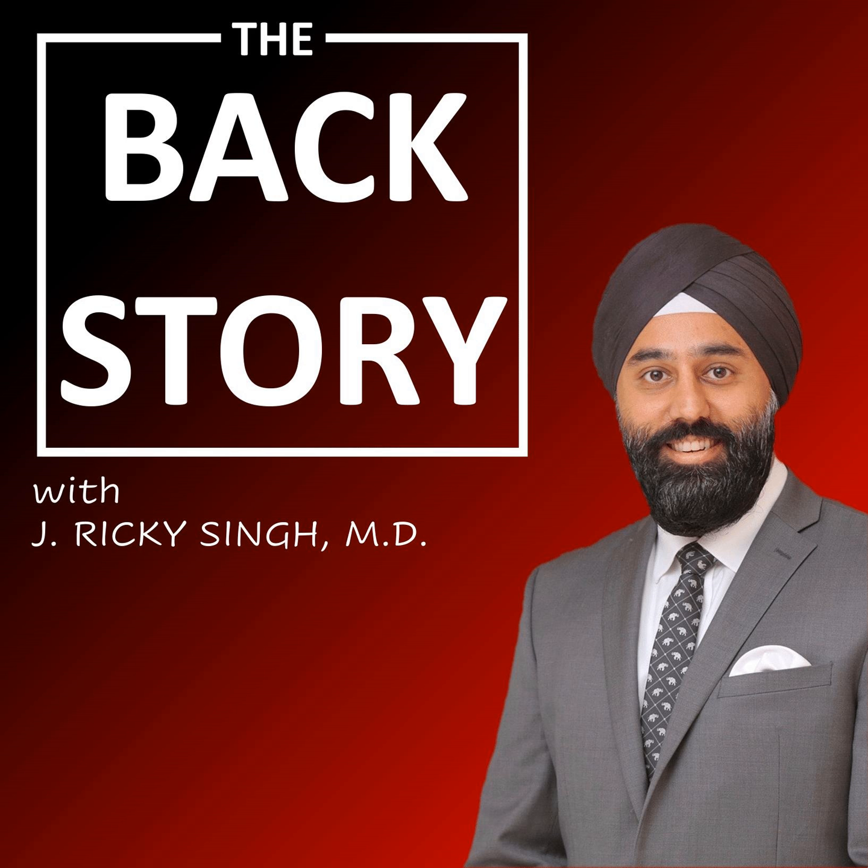You know, most of the research out there on spinal cord stimulation is on patients who have back pain, neck pain, arm and leg pain. So mostly pain originating from the spine in some sense. But one of the newer indications and novel approaches for spinal cord stimulation is around the mechanisms of gastrointestinal motility, GI motility. Can you speak to us a little bit about what the research is showing on spinal cord stimulation for something called gastroparesis? Sure.